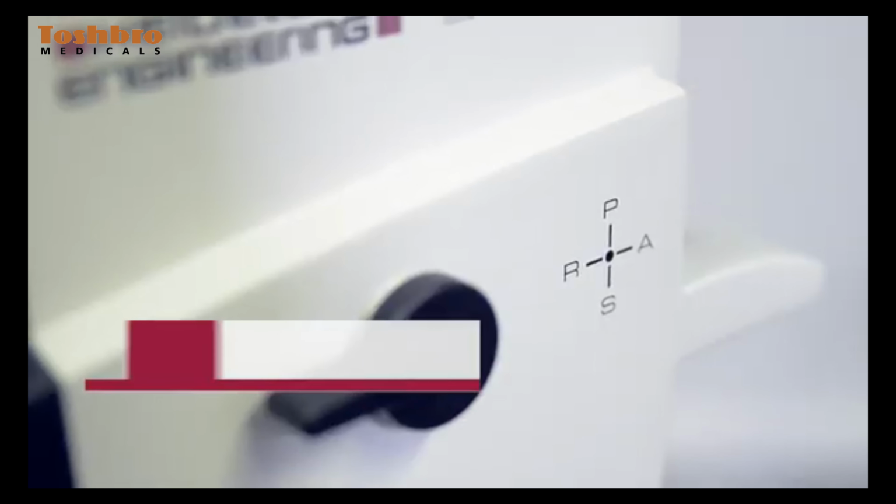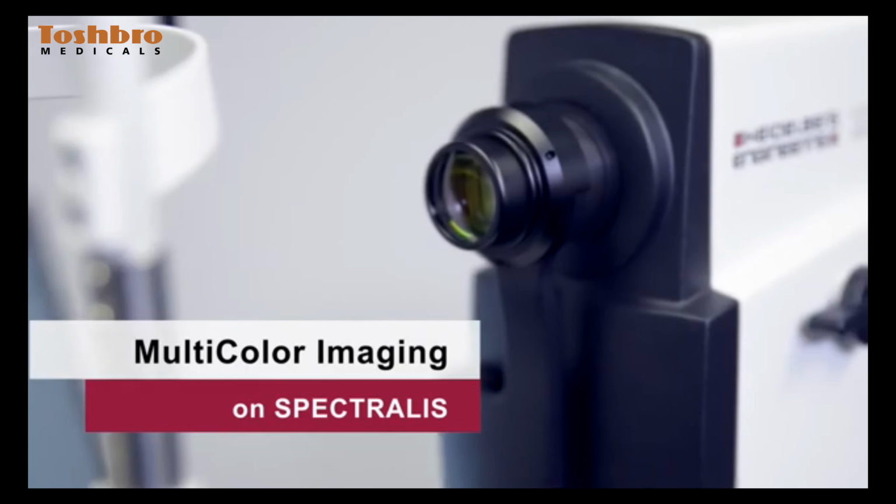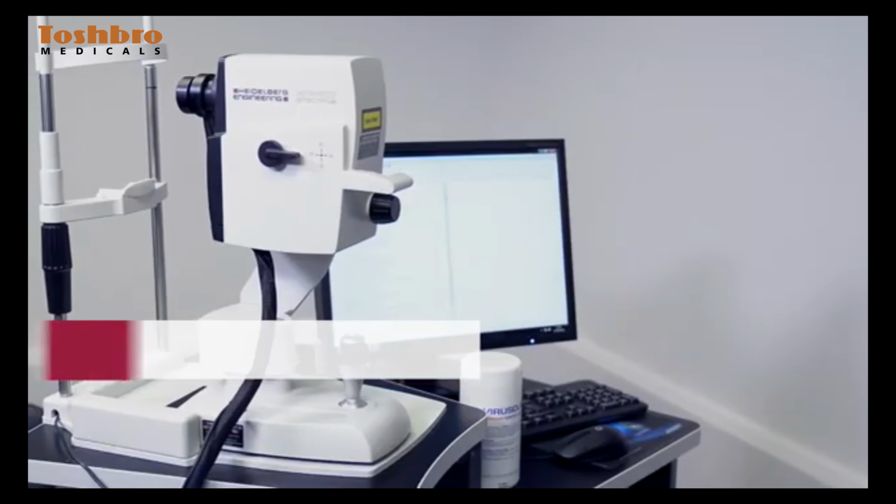This is a short instructional video on multicolor imaging for Spectralis users and will utilize infrared, multicolor and OCT modalities.